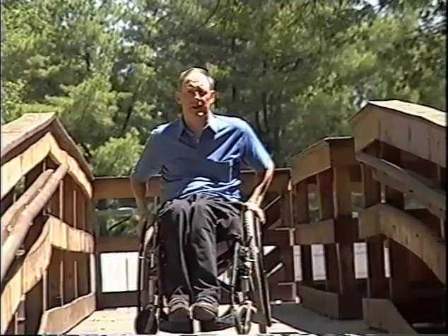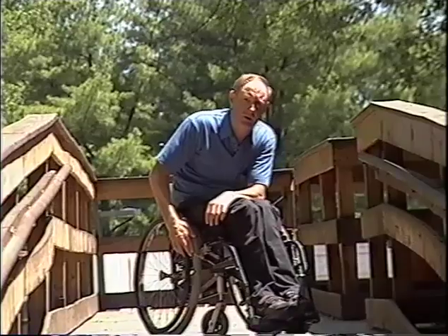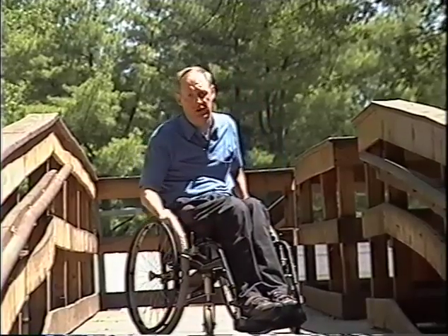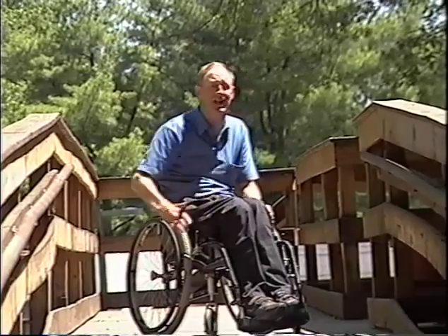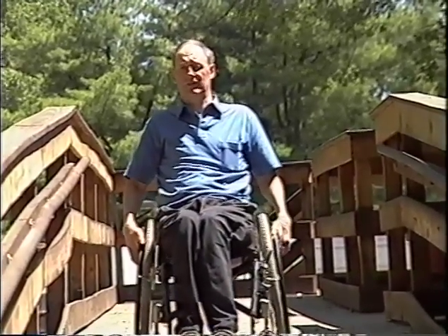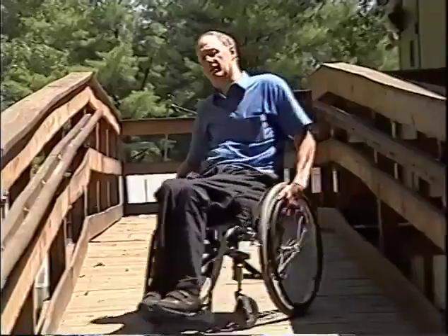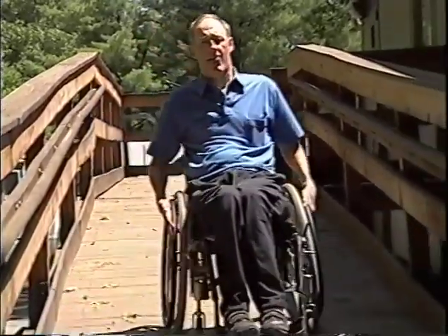So that's the two main things, and let's just see how this looks in reality. When you come to going down ramps, one of the main things to remember is to keep your weight back. The reason for this is when you're stopping the wheelchair, you'll be holding your wheels with your hands, and that's going to be pulling you forward. So if you keep your weight forward, you end up pulling yourself forward, plus you're transitioning down. So when you come down a ramp, simply lean back, letting the hand rim slide between your hands. And if you want to go left, take a little left. Right, right. Pretty simple thing for most paraplegics. And keep your weight back when you get to the bottom of the ramps for transitions too.